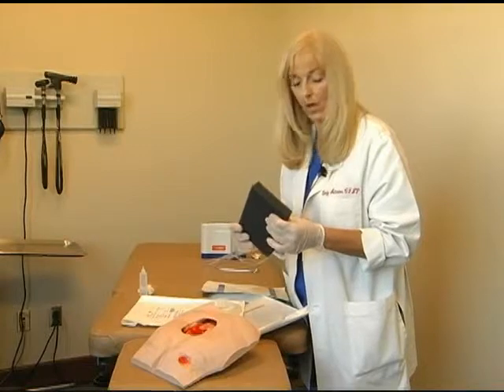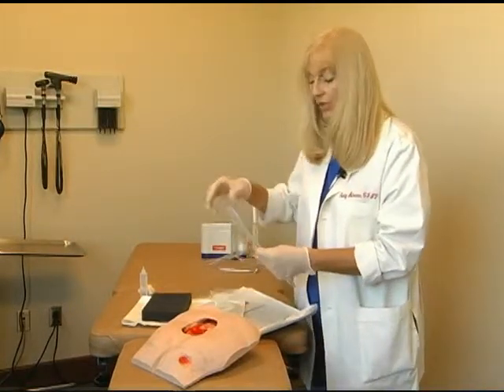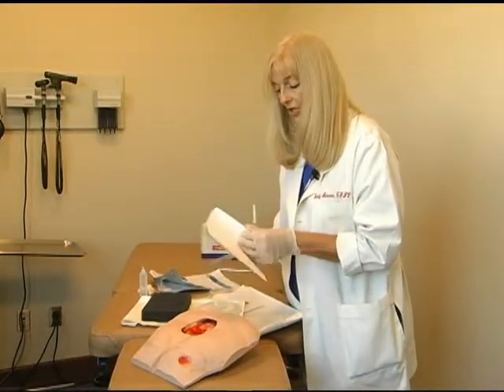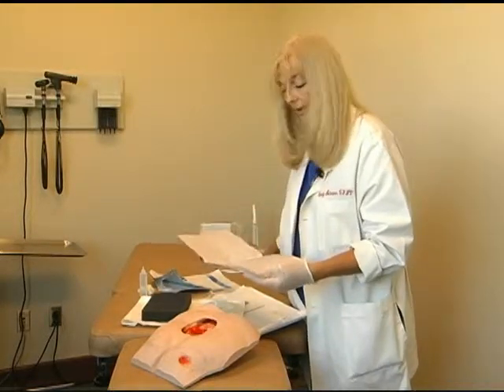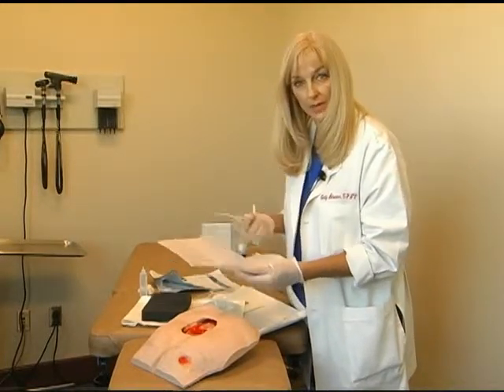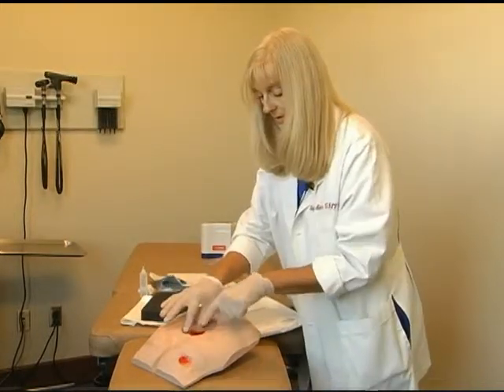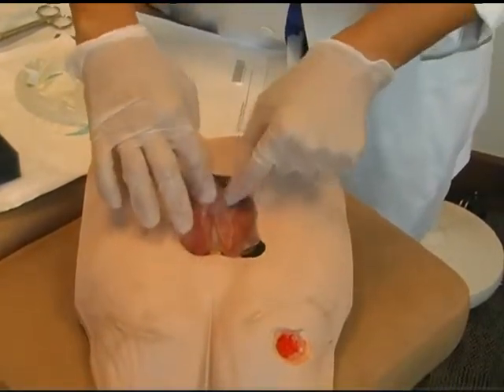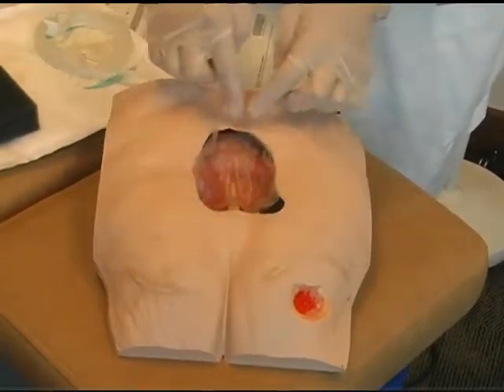If black foam is selected, one of the optional steps to prevent the ingrowth that goes with black foam is to use a non-contact layer, such as the Dermanet. The Dermanet AG also offers a silver component for microbial control. Custom cut the Dermanet layer and lay it on top of the granulation tissue, making sure that the non-contact layer stays within the wall or the margin of the wound.